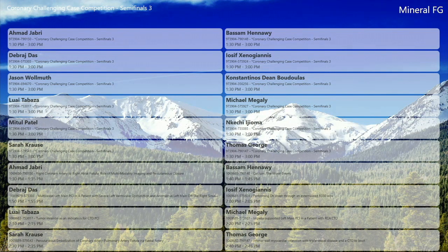The difficult thing with this is you got stuck in a very, very tight lesion in the proximal LAD, so you have probably no chance of deploying it there. The problem was that it's stripped off. The stripping will make deploying it very difficult. If it was still in an intact position, we can do it. But if it's stripped, I think it's better to be pulled out. I'm not sure it would have expanded though if you deployed it, if it was that calcified in your proximal LAD. Yeah, and part of it was in the left main. So yeah, it will be a problem if you didn't crush properly. That's good.